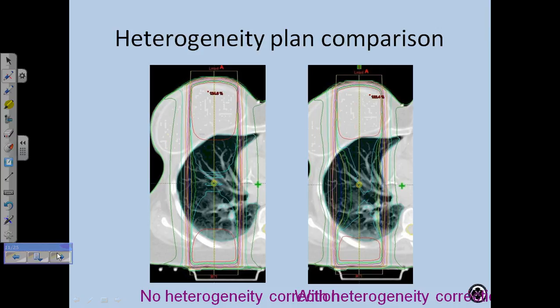So the photons that would have deposited their energy down here, look at this isodose line right now. That isodose line has moved inwards. Okay, so if you trace this blue one, for example, this is way over here now. And so where is this energy going? This energy that would have gone here is now leaving the radiation field and it's going outwards. And you see how they bow around the lung, and they don't bow around the lung in this case.